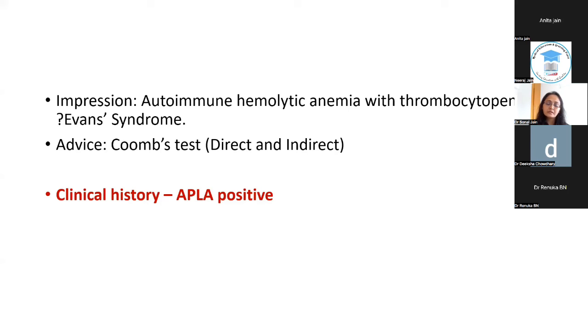And in an autoimmune hemolytic anemia, DCT would be by convention strongly positive. A 3+ or 4+ DCT positive. Why I'm mentioning this here is that a low grade 1 or trace positive DCT is not important, because that could happen because of coexisting infections, hospitalizations, and a lot of other things. A strong positive direct Coombs test is what is confirmatory for an autoimmune hemolytic anemia, and we do see this.